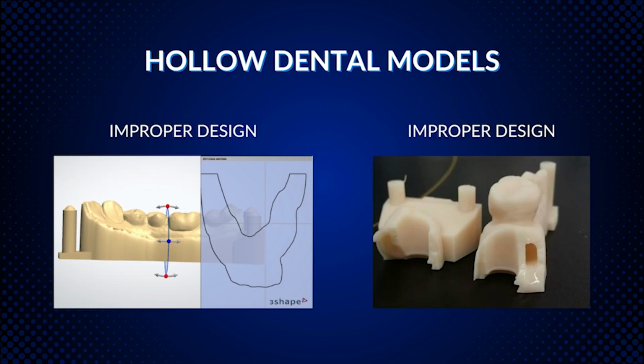Next, we're going to talk about hollow models, right? Everybody wants to print hollow models. It's the big thing to save resin. I have a couple things to say about hollow models. Yes, they're great. They have their applications.